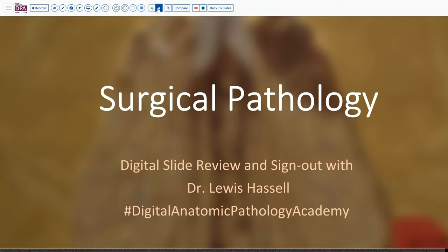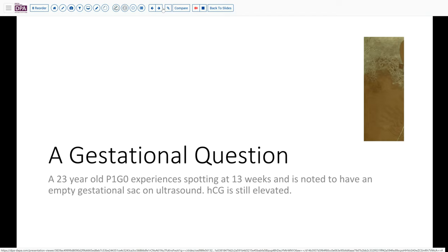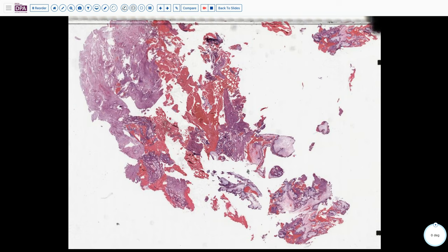Our case today comes from the realm of gestational neoplasia — it's a question of neoplastic or not. A 23-year-old woman in her first pregnancy begins to experience spotting at 13 weeks, concerned for either missed abortion or some other problem. Ultrasound shows an empty gestational sac, but her HCG is still elevated, so an evacuation procedure is performed and you can see here some curettings from that.